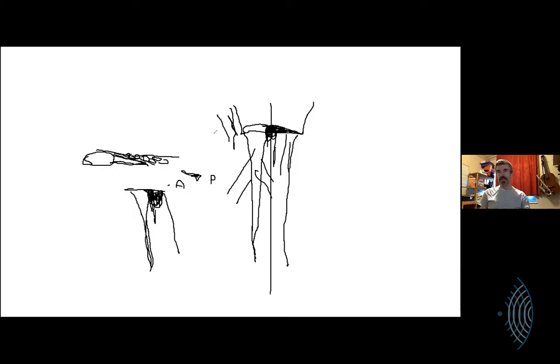It's a little bit of breakdown at the boundary between the posterior and the anterior. A degenerative tear. Yeah, a degenerative tear. So in my population, 85 to 95% of tears are degenerative tears, probably. And they start in this area here, and they get bigger posteriorly, and they come back, and they're often probably full thickness, but because there are so many fibers of infraspinatus going over the top, people don't think of them as partial tear.